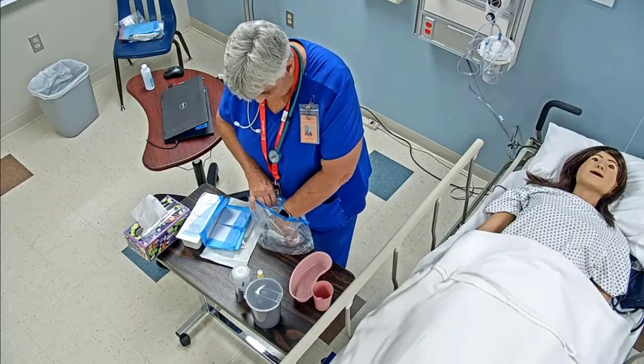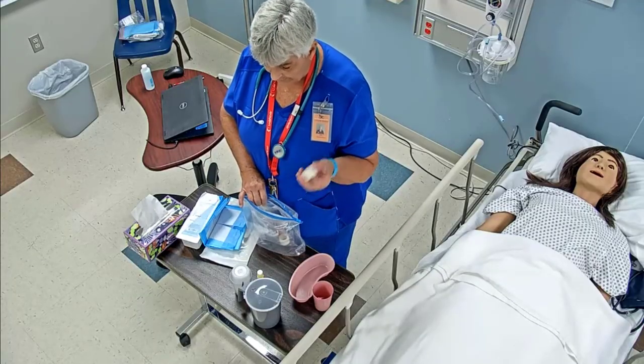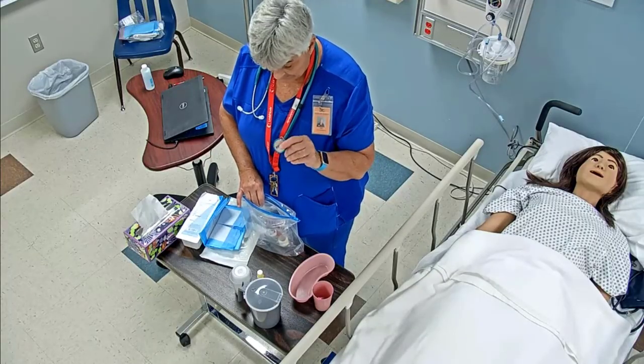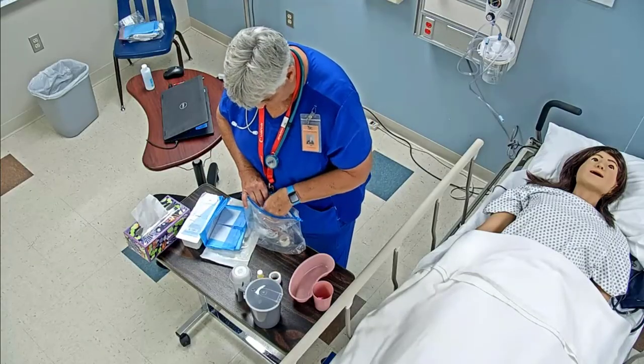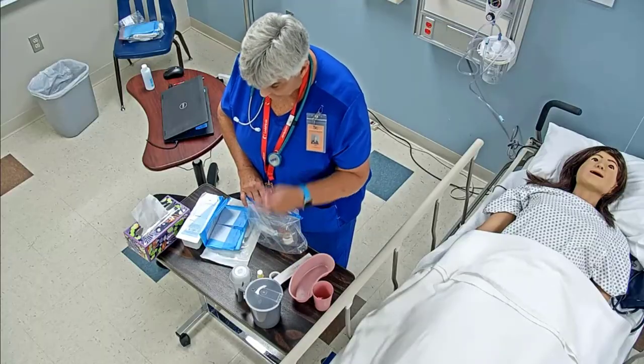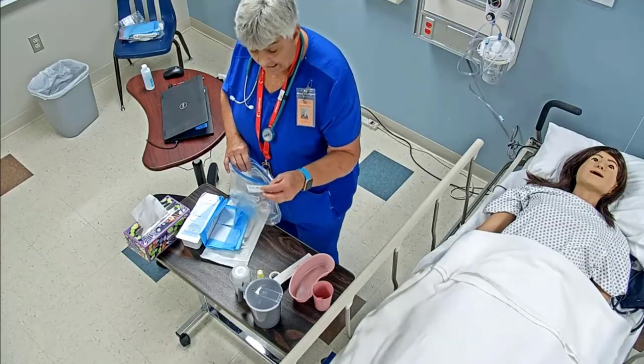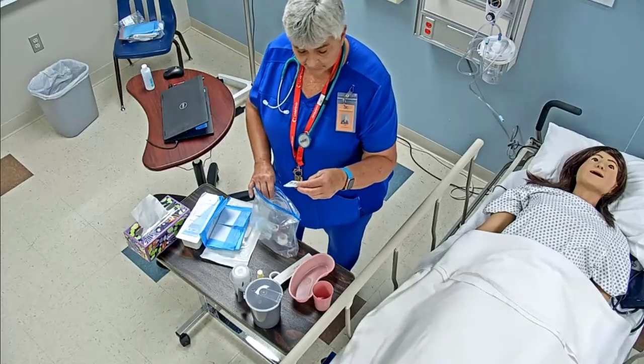I'm going to need some paper tape in this, but in the hospitals they have securement devices, and so I will make sure I have the correct one of those. Sometimes you may need a tongue blade if we need to look in the back of the throat and we can't see just with our pen light.